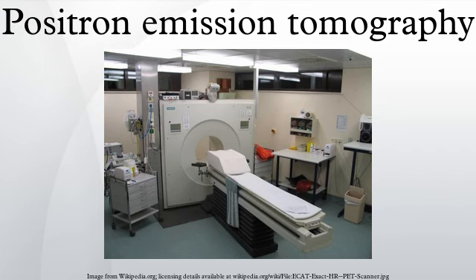Attenuation correction. Attenuation occurs when photons emitted by the radiotracer inside the body are absorbed by intervening tissue between the detector and the emission of the photon. As different LORs must traverse different thicknesses of tissue, the photons are attenuated differentially. The result is that structures deep in the body are reconstructed as having falsely low tracer uptake.